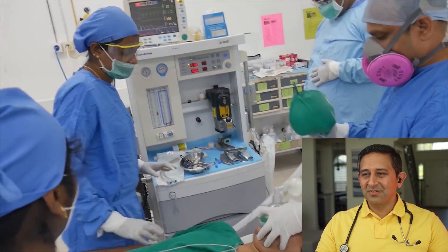They are still in the process of making sure the patient is getting deeper under anesthesia, because when the breathing tube has to be placed the patient has to be in a certain plane of anesthesia to prevent complications. Either the patient has to be completely awake or in a certain plane of anesthesia — if done at an intermediate stage that can lead to problems. The doctor is saying we should wait for 4 minutes; they may have given a muscle relaxant medicine which takes about 4 minutes to work.